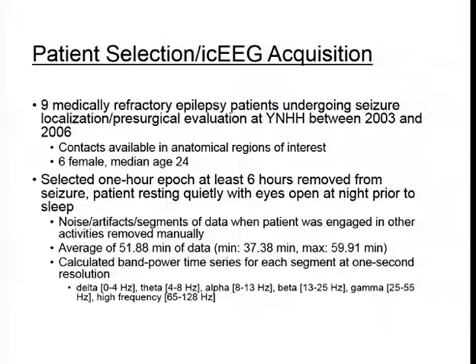For each hour-long segment, we manually removed noise and artifacts, and segments when the patient was engaged in other activities — such as interacting with nurses, drinking water, or having a snack. This left us with an average of 51.88 minutes of data per patient, with a minimum of 37.38 minutes and a maximum of 59.91 minutes.